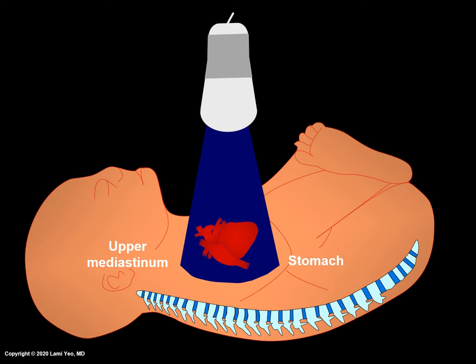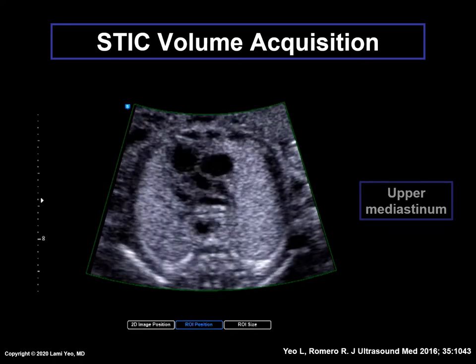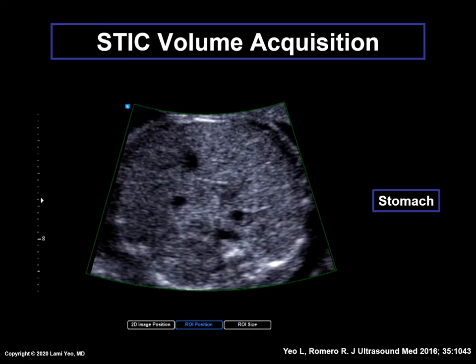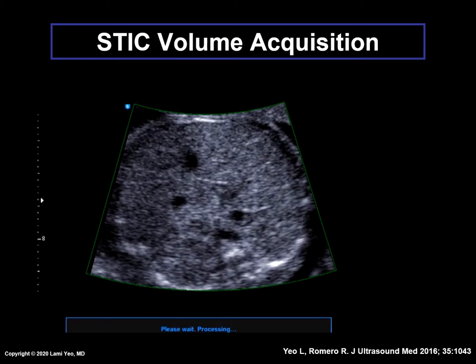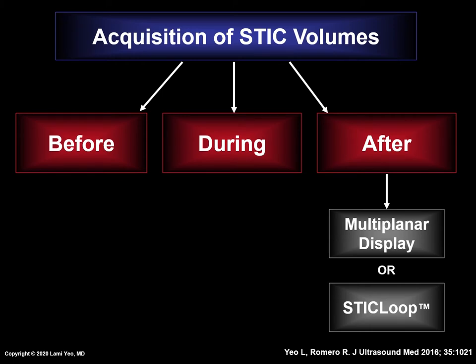With the four-chamber view as the acquisition plane and applying appropriate settings such as the acquisition angle, the volumetric ultrasound probe should automatically sweep from the fetal upper mediastinum down to the stomach. Here is an example of a STIC volume being acquired. It sweeps from the upper mediastinum, through the four-chamber view, and then down to the fetal stomach. When completed, the STIC volume display comprises thousands of two-dimensional images acquired through the area of interest during this single automated sweep. There are three main time points that deserve focus: before the acquisition, during acquisition, and immediately after, in which either the multiplanar display or STIC loop is examined to determine if the volume is appropriate for analysis.